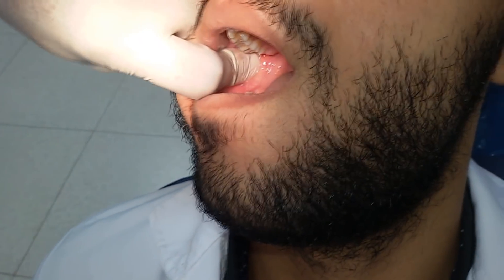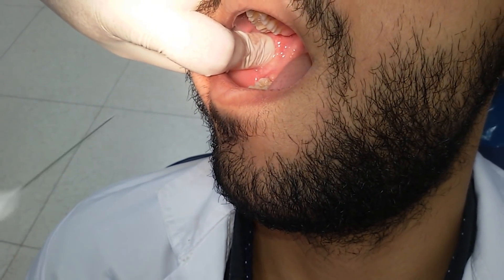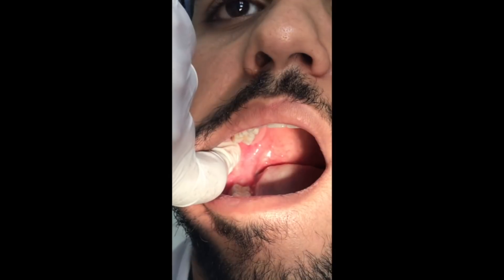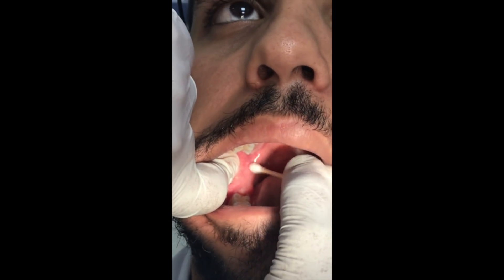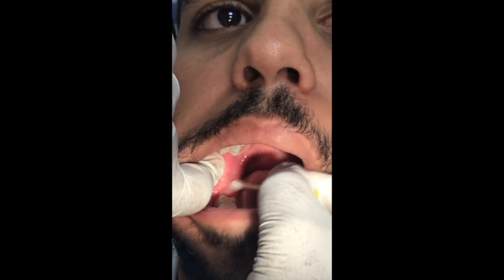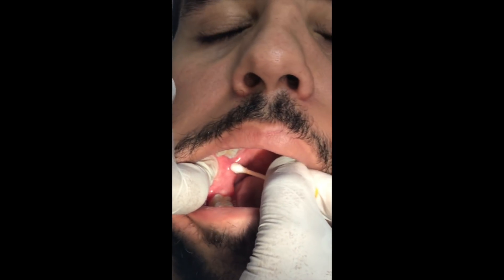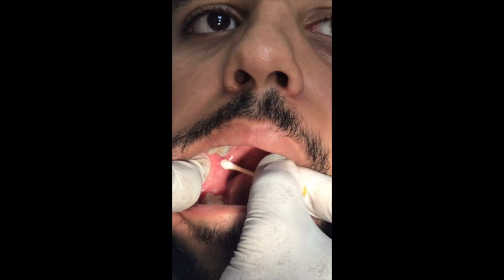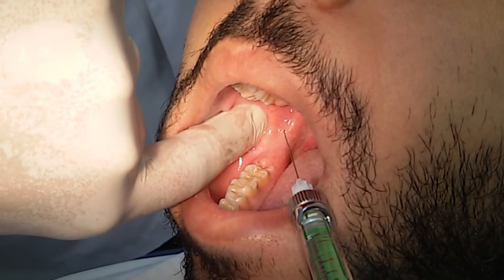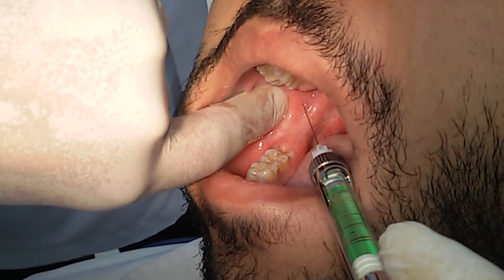The midpoint on your fingernail is the first of two reference points. The second point is a point on the pterygomandibular raphe where it changes its course from horizontal to vertical. The line that connects these two points — on your fingernail and on the raphe — should be divided into medial one-third and lateral two-thirds, or medial one-quarter and lateral three-quarters. This is the point of needle insertion. Direct your syringe from the contralateral side, passing over the contralateral premolars, to penetrate the tissues at the point of insertion.